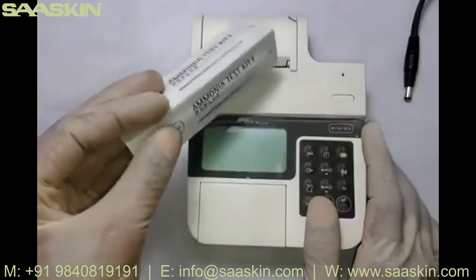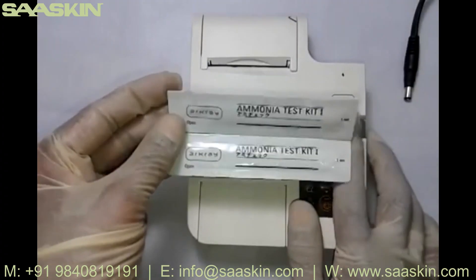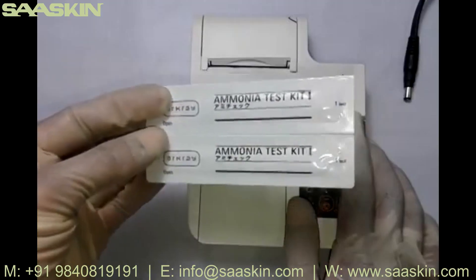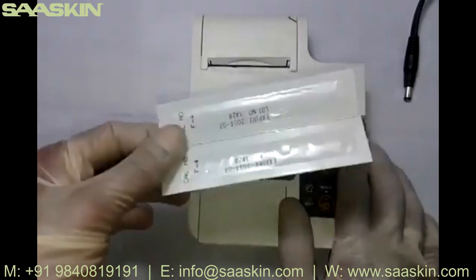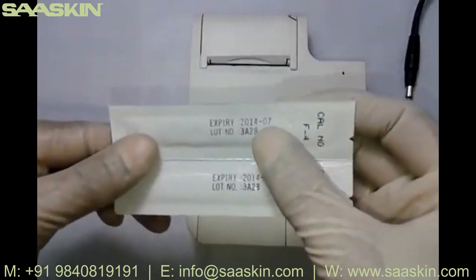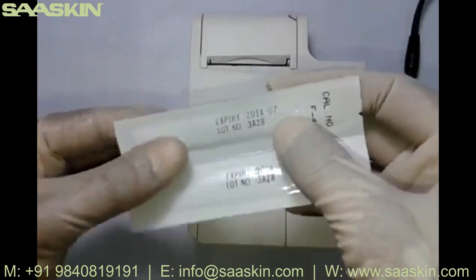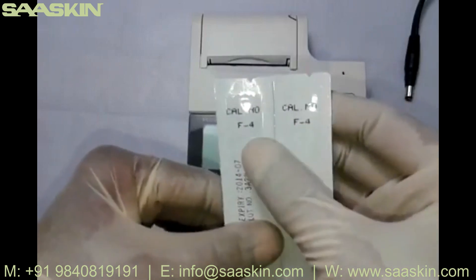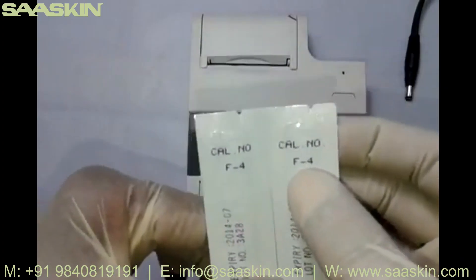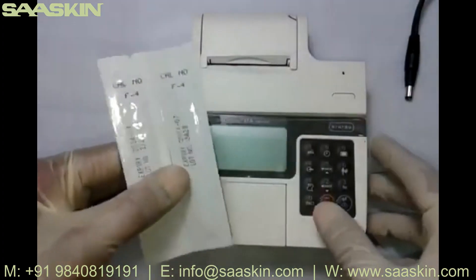The advantage here is that all the ammonia strips provided with the Pocket Chem BA are individually aluminium-foil packed. You don't even need to refrigerate these strips — they can be kept at room temperature — and they come with an expiry of one and a half years, 18 months. The current strip I'm holding is from July 2014. Each batch comes in a pack of 50 with a particular code number; this batch has code number F4.